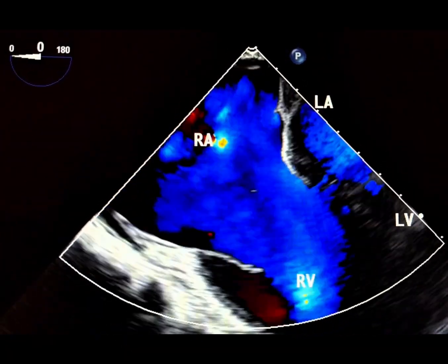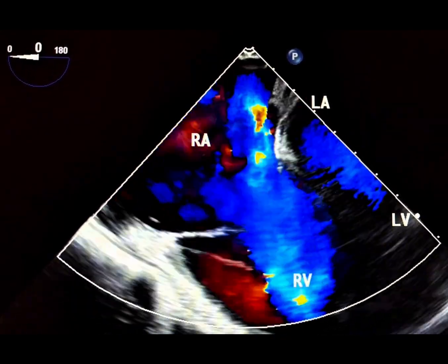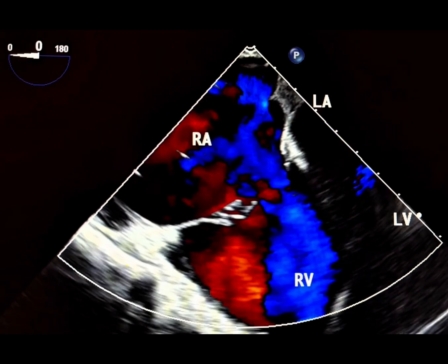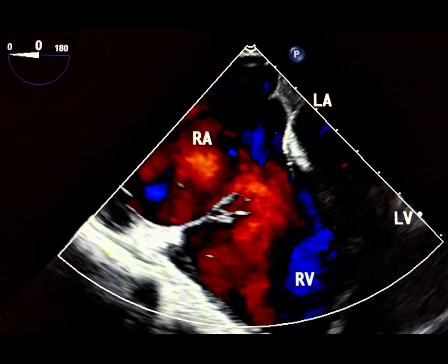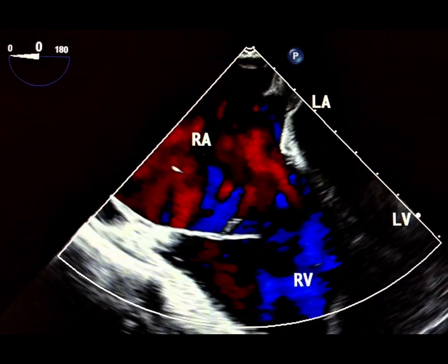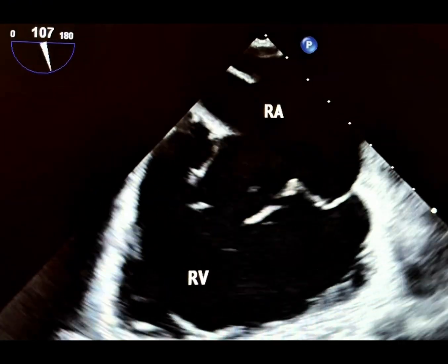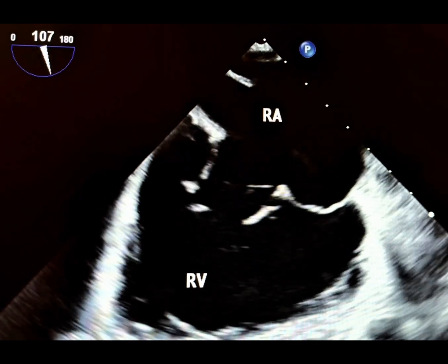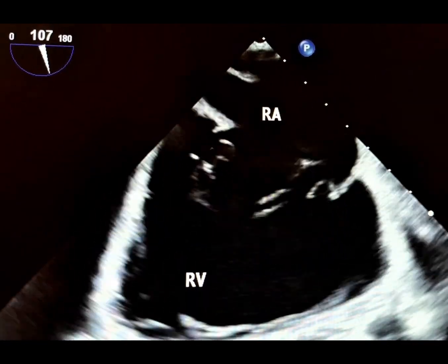Color Doppler demonstrates a wide tricuspid regurgitation jet. The TR jet may be directed posteriorly or centrally depending on the damaged leaflet. Sudden deceleration leads to an abrupt RV pressure rise during end-diastole or early systole.